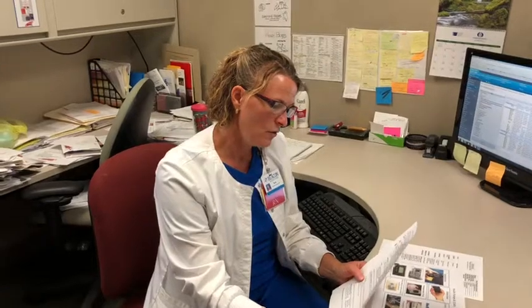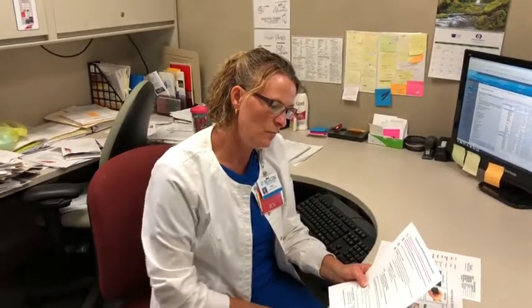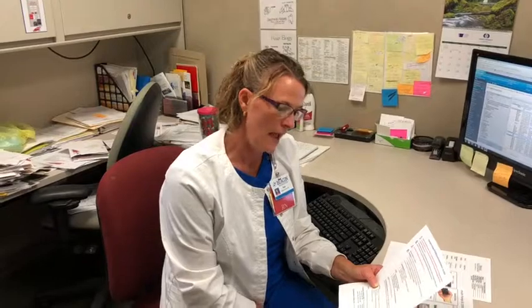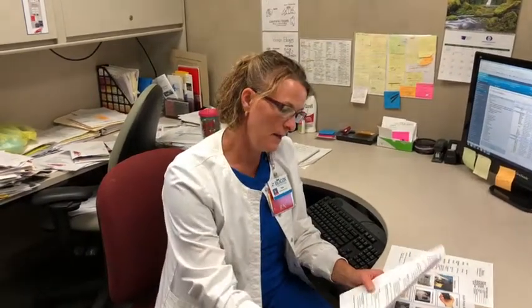Routine care, you're going to treat whatever glucose orders your ER docs are ordering, but if the patient has 2 blood glucoses 300 or more in a row, you're going to ask them to administer a correction bolus via their pump, recheck the sugar in 2 hours if they're still there, and then if the blood sugar still stays over 300, you're going to ask them to change out the site and cannula, or if they don't have the supplies, just remove the pump and get alternate insulin.